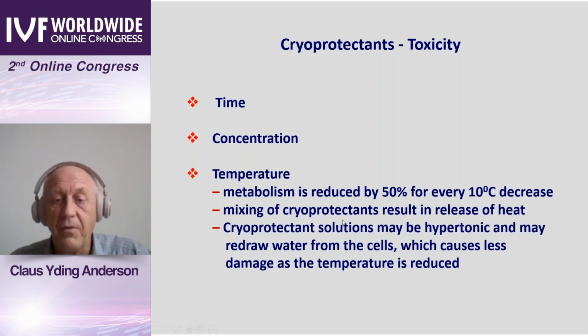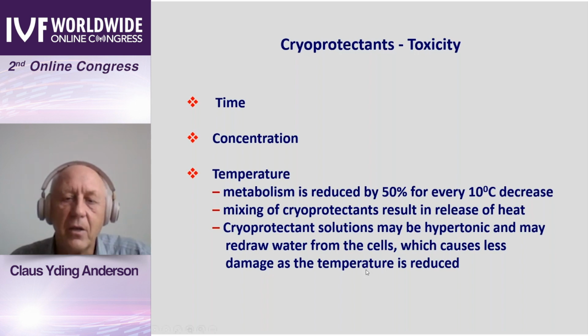And you also have to understand that cryoprotectant solutions may be hypertonic. So if they have too high an osmotic pressure, they will draw water out, and this may not be the right way to do it, and it potentially could damage the cells.